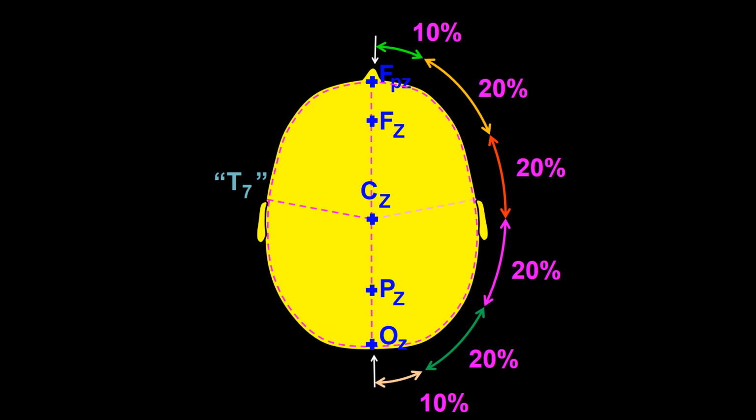I like to emphasize that the percentages given here correspond to half the head circumference, but if instead we consider the full head circumference, then the percentage would have to be half. But for the moment it is fine to keep it as we have done from the beginning.